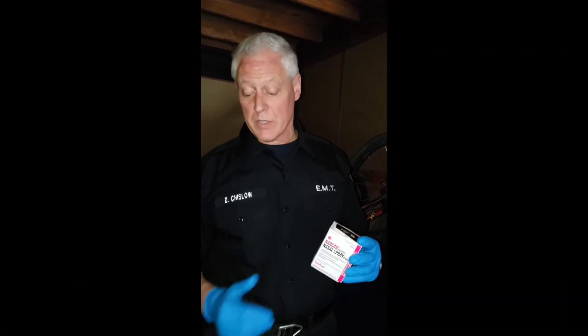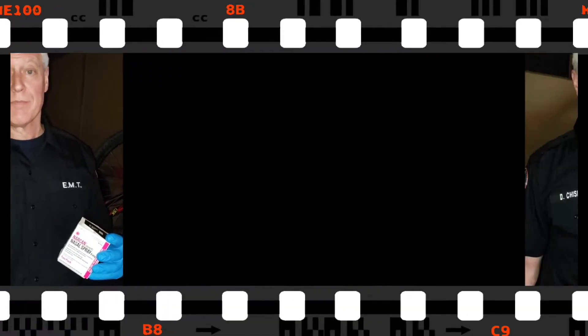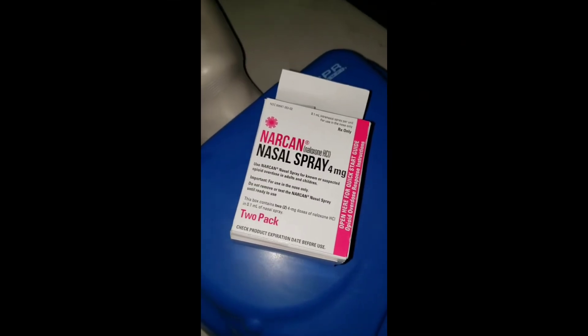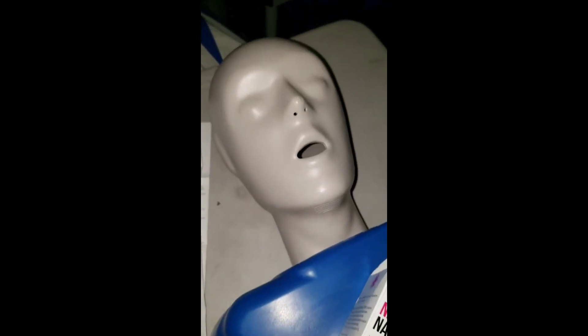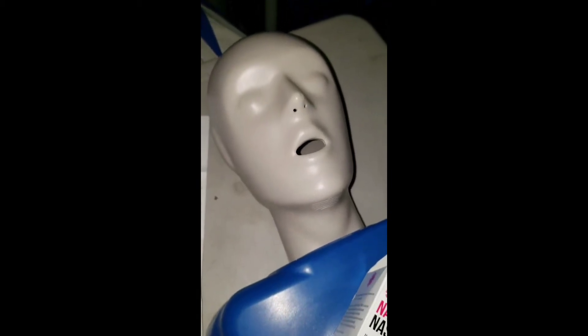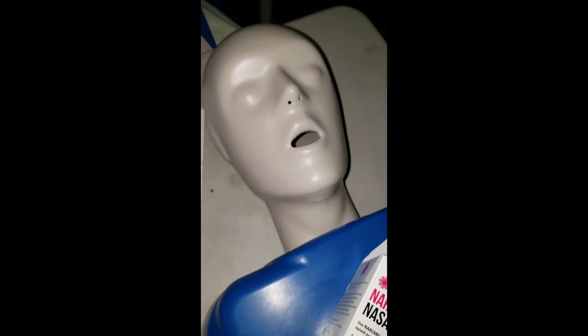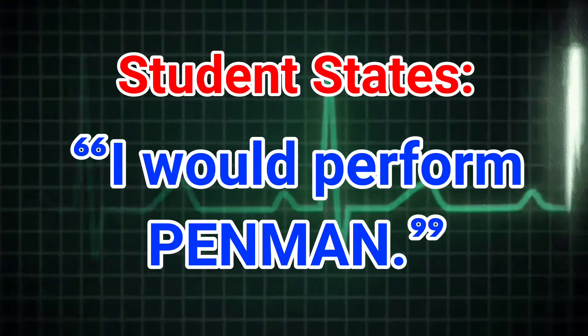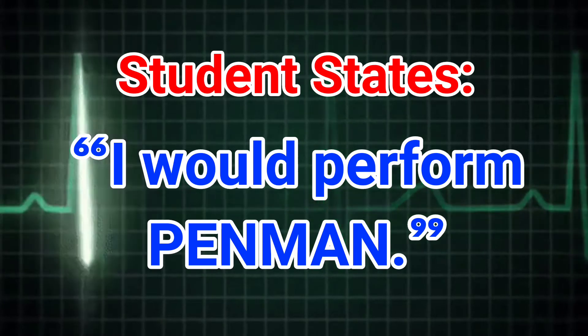Today we're going to look at Narcan administration to an unconscious patient. Approaching the patient, I would go through my PENMAN protocol. I would introduce myself: Hi, my name is Don, I'm an EMT. May I help you? I would assess the patient's level of consciousness and obtain vital signs. Student states: I would perform PENMAN.